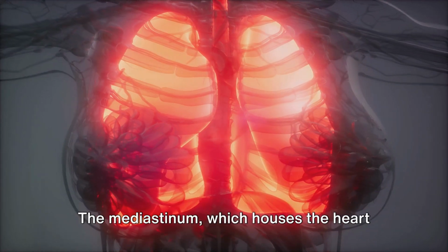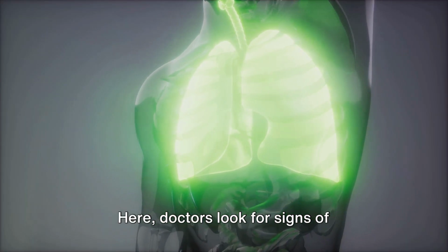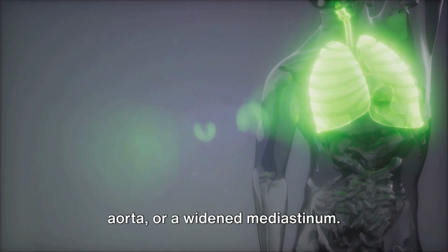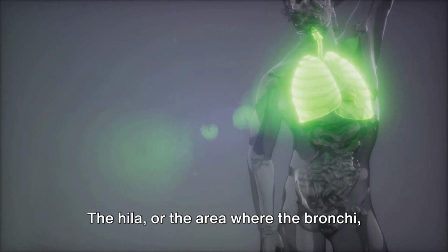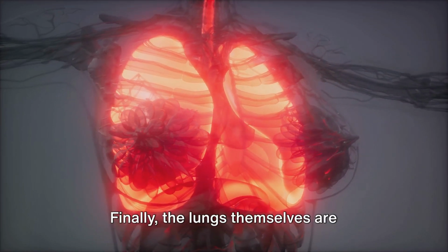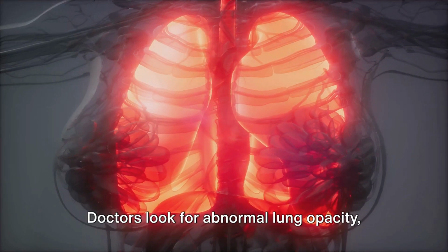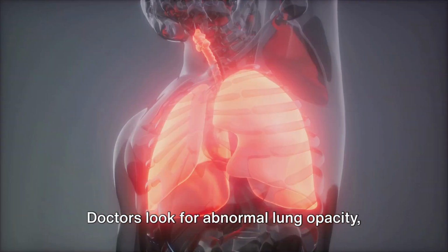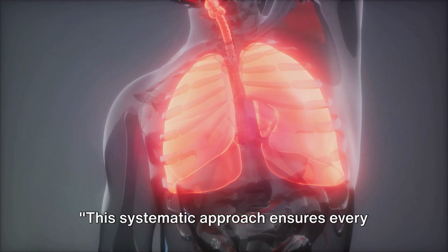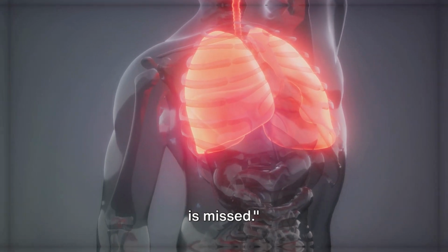The mediastinum, which houses the heart and great vessels, is evaluated next. Here, doctors look for signs of cardiomegaly, tracheal shift, a tortuous aorta, or a widened mediastinum. The hilum, or the area where the bronchi, blood vessels, and nerves enter the lungs, are assessed as well. Finally, the lungs themselves are examined, including the lung parenchyma, pleura, and diaphragm. Doctors look for abnormal lung opacity, pleural effusions or thickening, and compare the right and left hemidiaphragm. This systematic approach ensures every part of the chest is examined and nothing is missed.